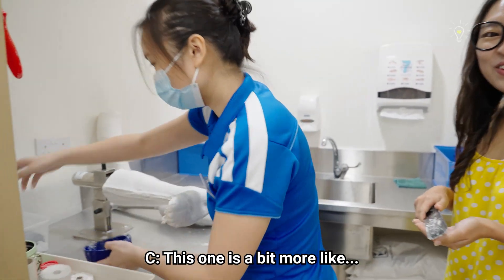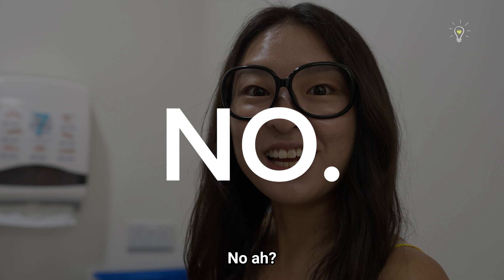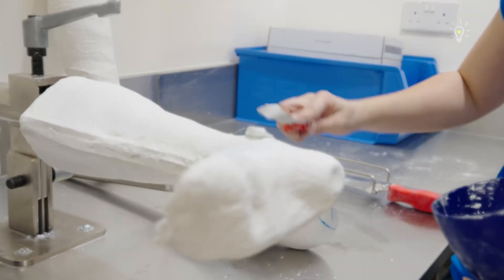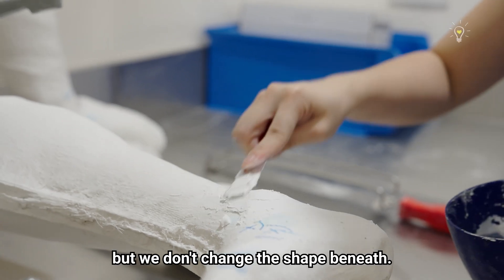This is a bit more like — do you bake? Once in a while. So you want to add it on in a dome shape. Now it's a bigger version of what it was before, but we don't change the shape beneath.